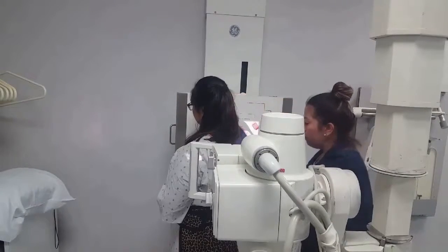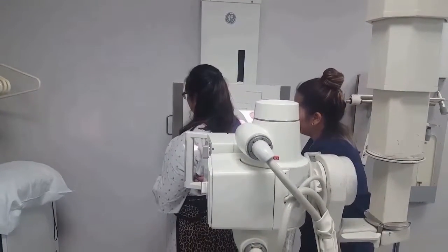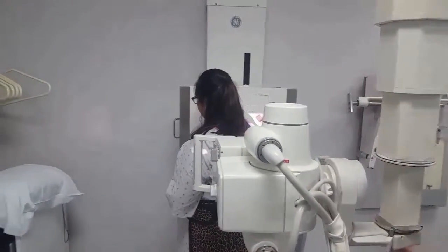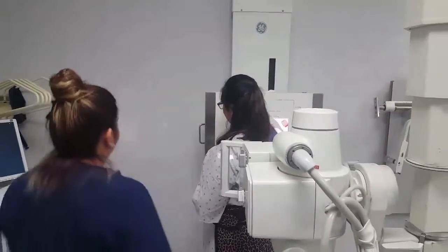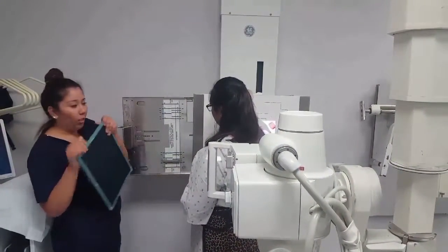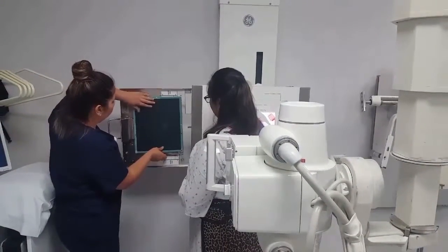Place that there, just making sure. Okay, so once we have that there, another thing for this one, you do have to change your IR. It's a portrait orientation.